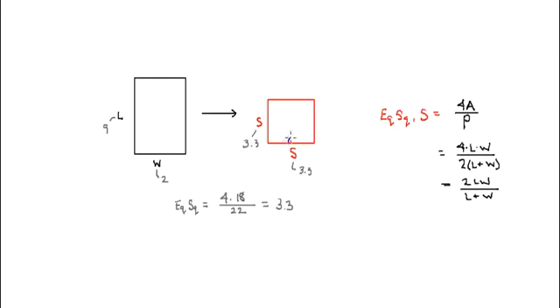So one final thing is that there may be some blocking in the field, like here as I showed before. And so then the question becomes, what is the equivalent square of this field, this open part here that's irradiated? Some computer systems that do these calculations will estimate what the equivalent square is of this open field, and there are methods for this. I'm not going to go over those in detail because they're often done through software now, but a simple way to do it is to estimate what kind of rectangle would fit into the field, and you can estimate the equivalent square from that.